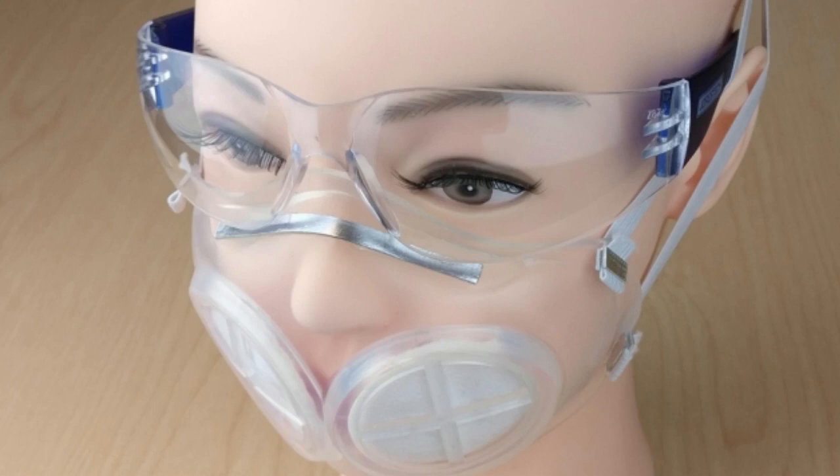Most of the mask is made of silicone rubber, and there is also space for one or two N95 filters. Those filters are designed to be replaced after every use, while the rest of the mask can be sterilized and reused.